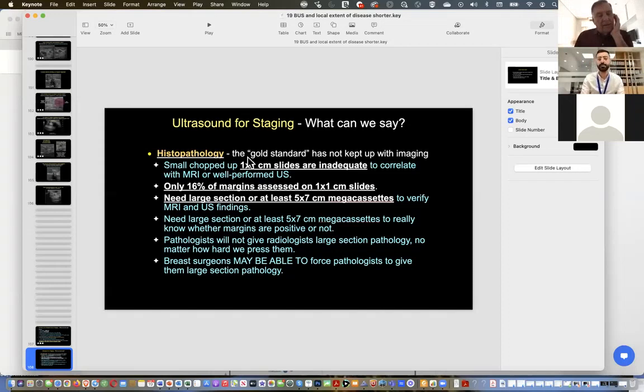I face patients with lumpectomy of breast cancer. She had a lumpectomy with free margins of malignant cells, but now after 1 month she has seroma, and on follow-up ultrasound, we discover there is a pathological lymph node that has cortical thickening. What do you suggest for this patient? Do we do FNA or biopsy?